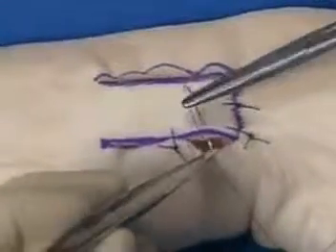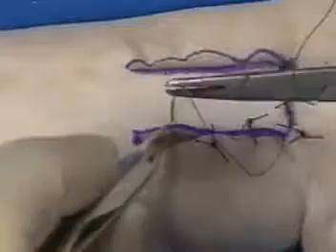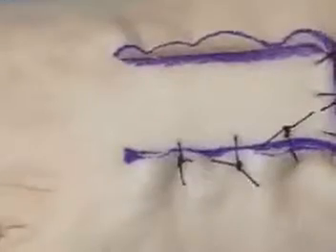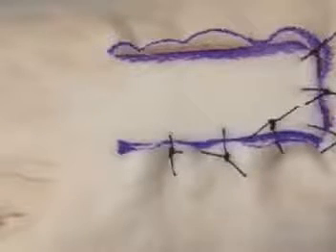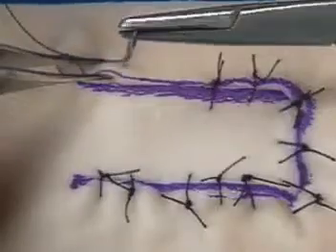Subsequent sutures are then placed so that it splits the difference between the previous sutures until enough sutures are placed for adequate closure. In this way, the redundant skin of the lower flap is spread evenly across the entire wound closure and results in a smooth wound edge.